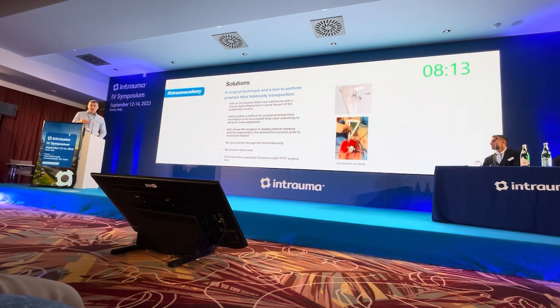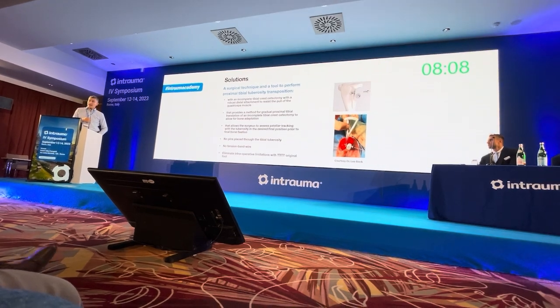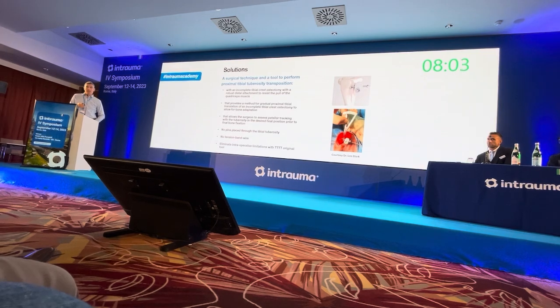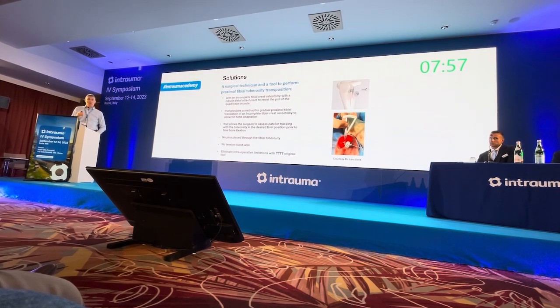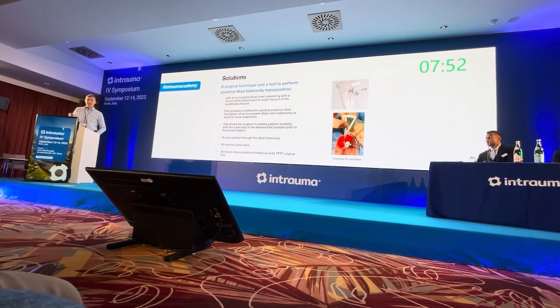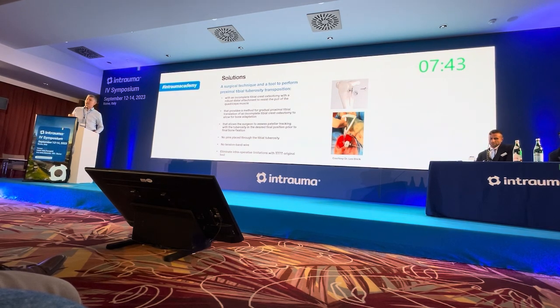He wanted to find a surgical technique and tool that allowed the surgeon to assess the patellar tracking prior to final implant placement, as well as a technique that would allow for no pins to be placed through the tuberosity, no tension band wire, and in the case of the TTTT2, P4T2, a tool that would overcome some of the early limitations of the original tool that I already spoke about regarding the size and the complexity of placing pins in small patients.